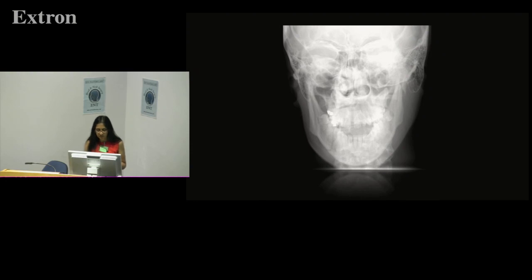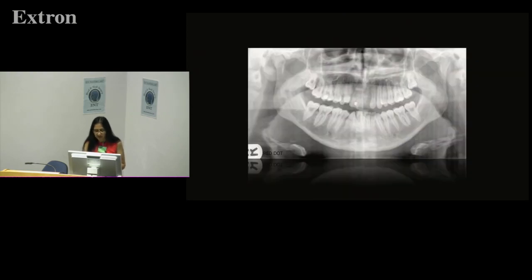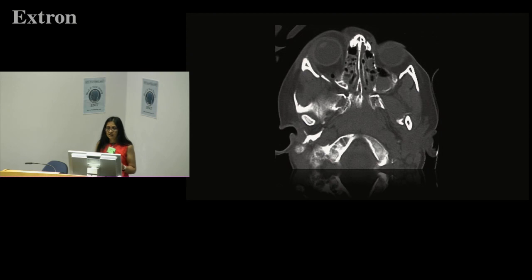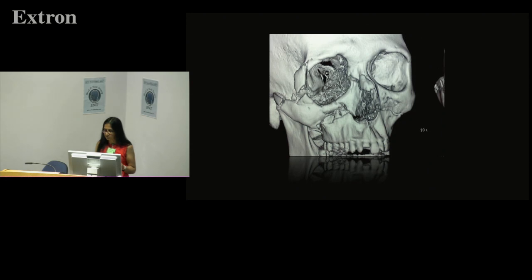Fracture of the zygomatic arch, as you can see here — plain x-ray is quite good. There is fracture of the mandible on both sides, and fracture of the neck of the mandible on the left side, though it's not very clear on plain films. Good plain x-rays are useful for fracture detection, and we're using more CTs for facial bone imaging. Maxfax also likes 3D reconstructions for surgical planning purposes.